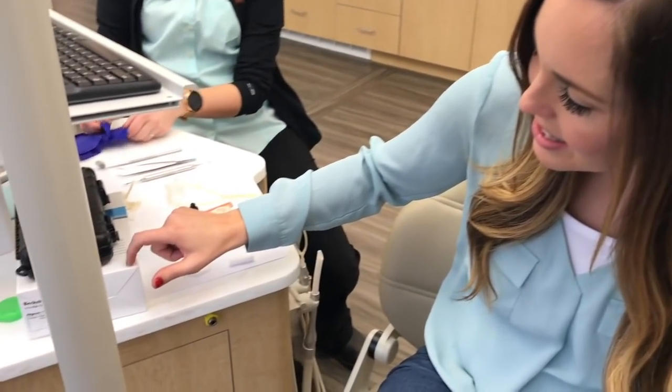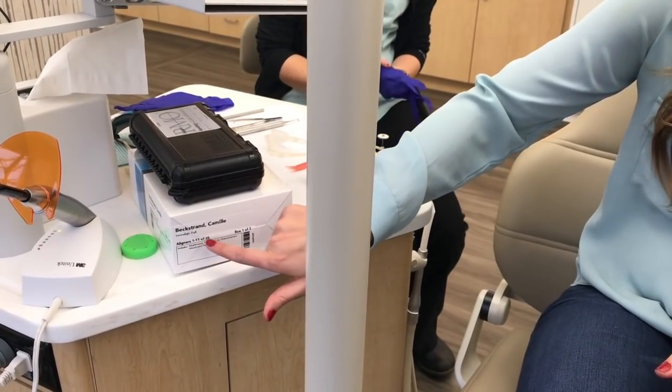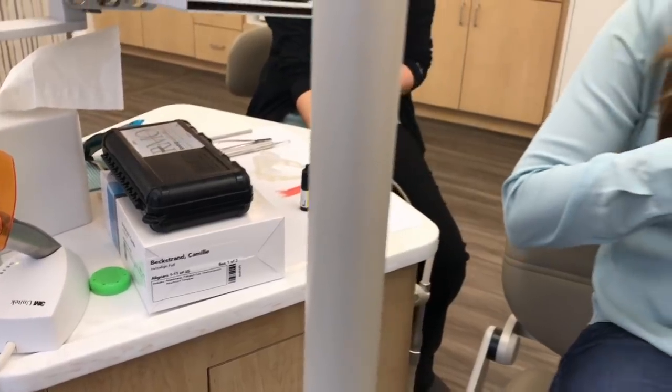So you can see here, this is gonna be my first box that I get — it's aligners 1 through 11 out of 35. So I have quite a journey ahead of me, but I'm excited to get going.